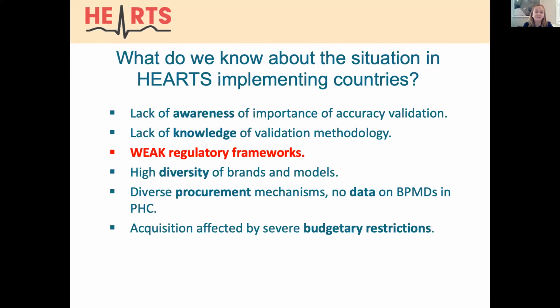There are diverse procurement mechanisms to acquire blood pressure measuring devices for use in healthcare facilities. It can be centralized, where the federal government buys, or the institution or the health area buys, depending on the country, or even the health center has some money, goes to the pharmacy and buys.